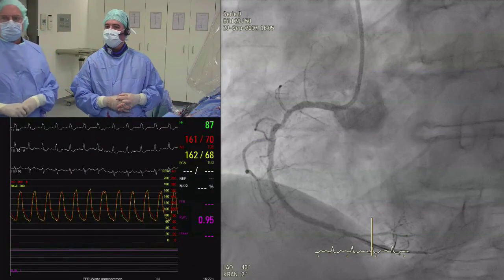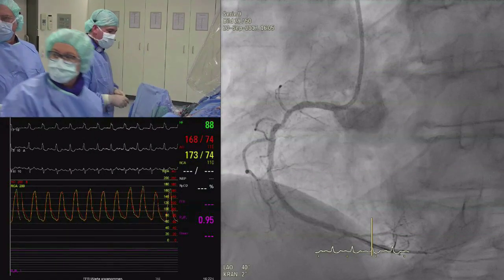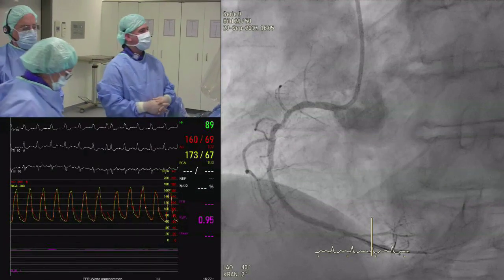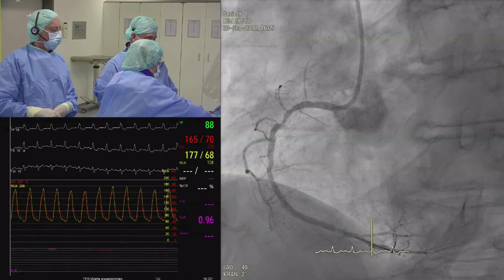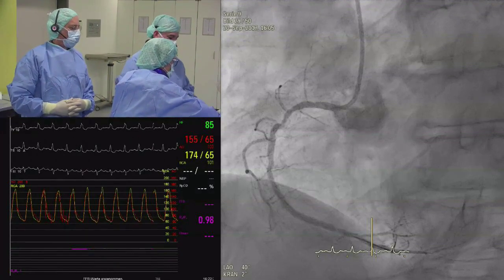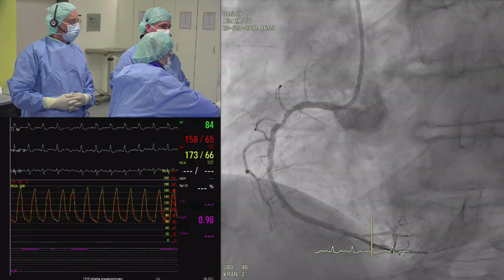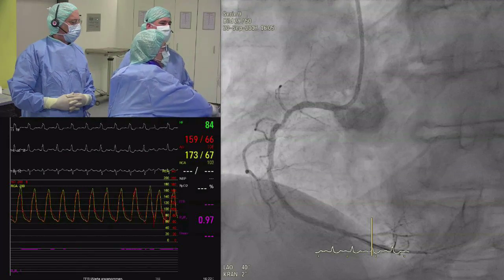Can we have a 2.5 by 12 non-compliant balloon, please? With Dr. Berry here, we were thinking about the 3.5, but perhaps we are overly aggressive. No, 2.5, I'm sorry. So we start with a 2.5 balloon, not 3.5. The balloon 2.5, but wouldn't you even try a 3.0 and see if it looks small? Just go with the 3.5 stent, because that vessel. No, sorry, I think there was a misconception. I said 2.75 or 3.0.